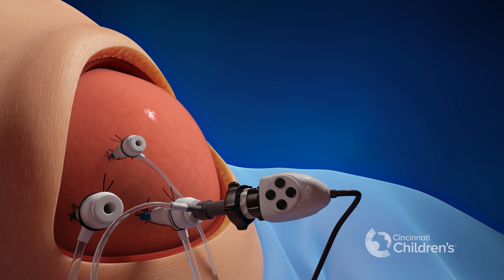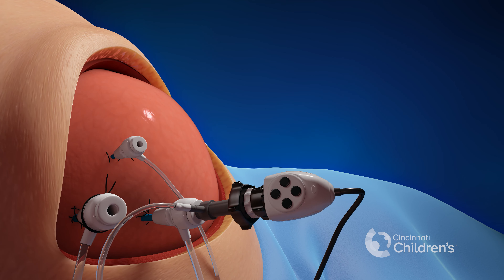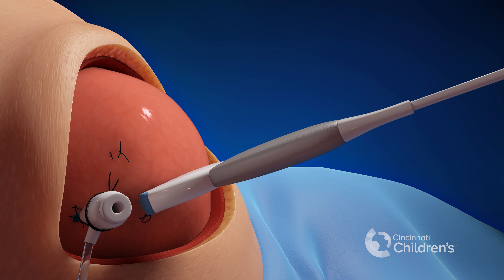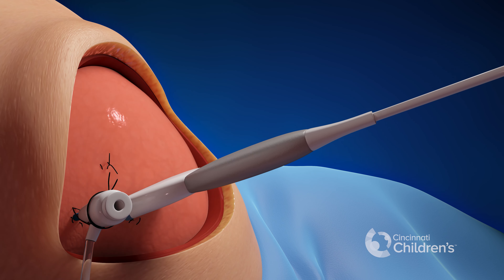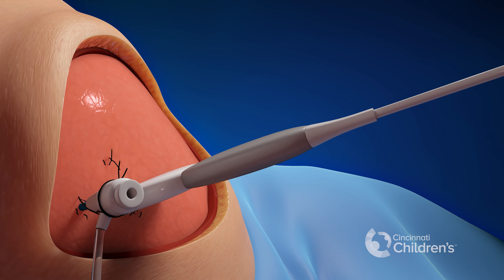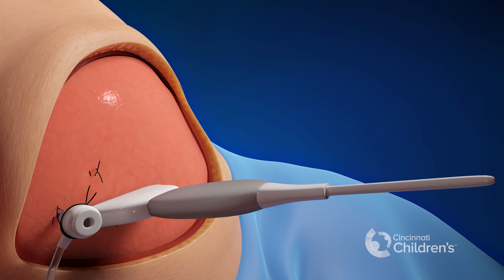The ports are removed and the port sites are closed with dissolvable sutures. The amniotic fluid we have removed is now replaced with warm fluid, and antibiotics are placed into the amniotic cavity.